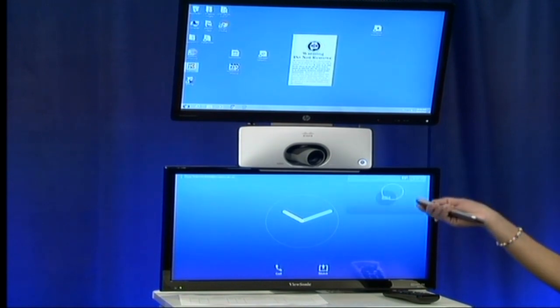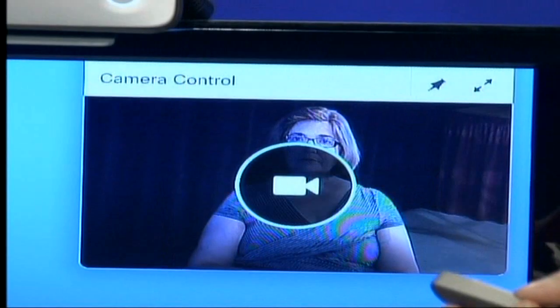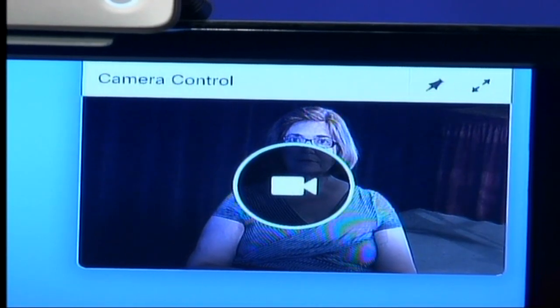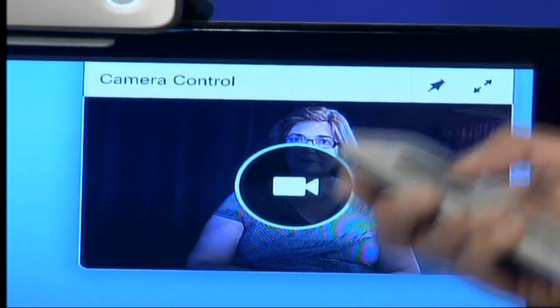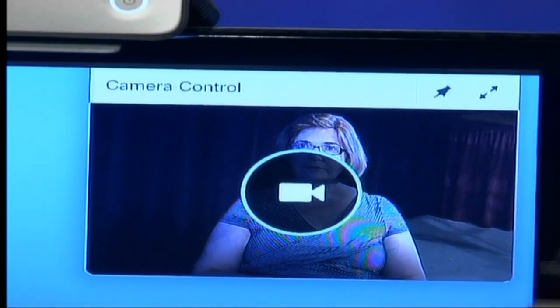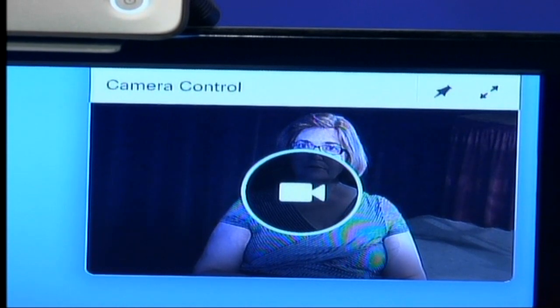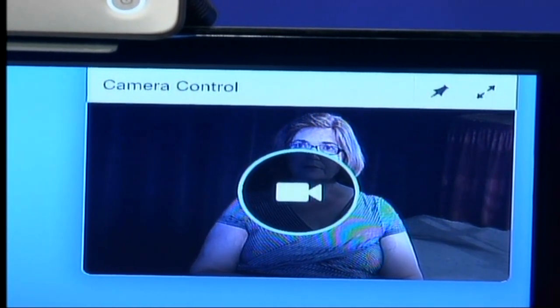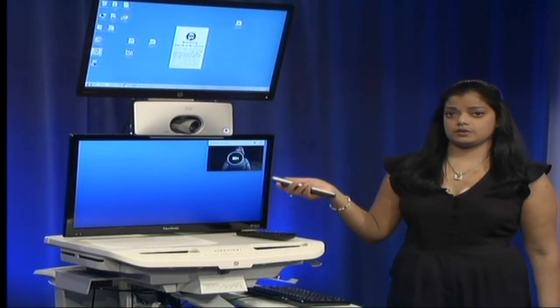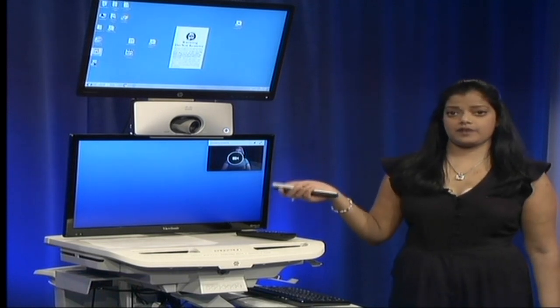Press the middle enter button, and you will see that the video camera is now on a patient. This video view is what the distant provider is seeing. So they will see you, your patient, and the clinic setting. So it is very important to create an optimal view using this as your guide for the distant provider.